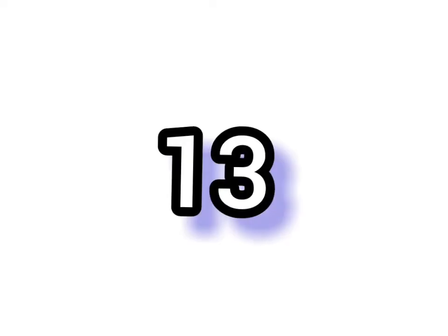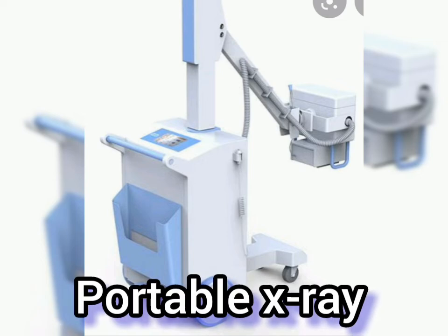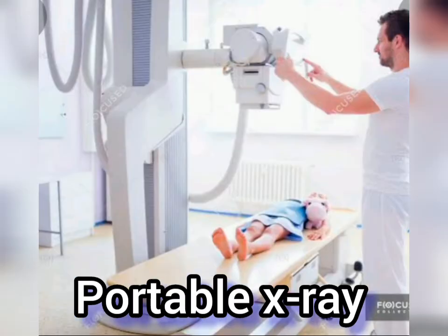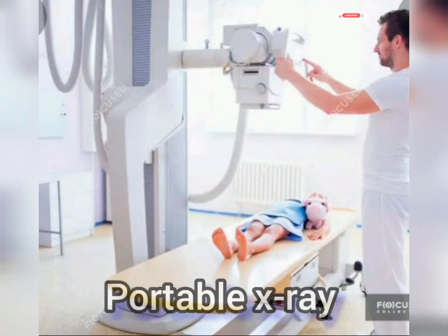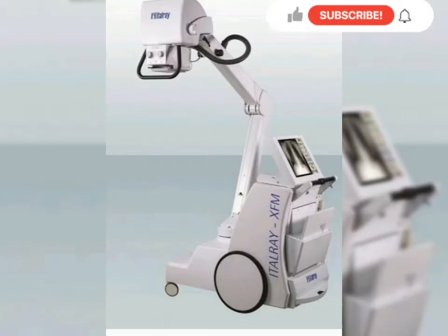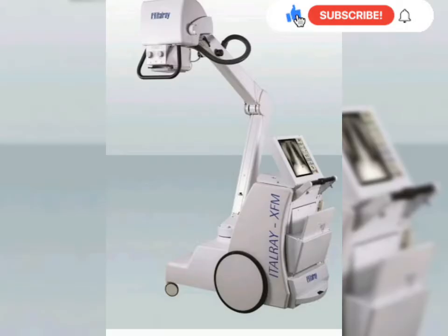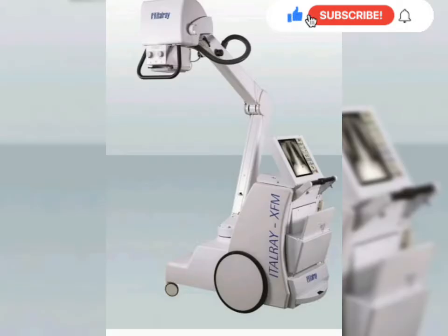Number thirteen: the portable X-ray machine is most important. For patients who are very serious and cannot be moved, the portable X-ray machine makes it very easy to perform X-rays right at the bedside in the ICU.